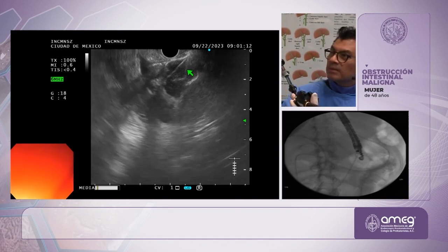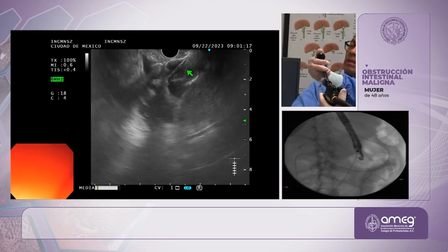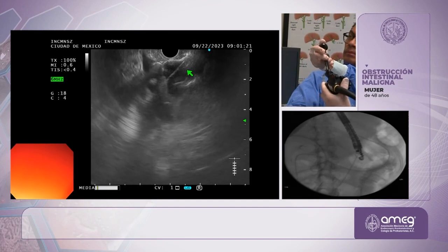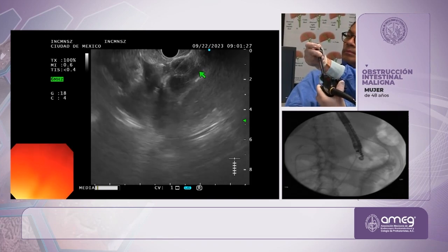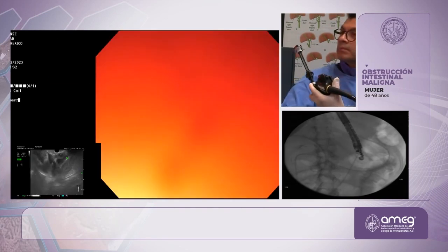Now I'm going to lock again. So the black is locked so I can deploy the proximal flange in the working channel. And I keep my eye on the ultrasound to make sure that distal flange doesn't move. It didn't move at all. Now I'm going to switch to the endoscopic view. We have our gas on. I've unlocked the black.